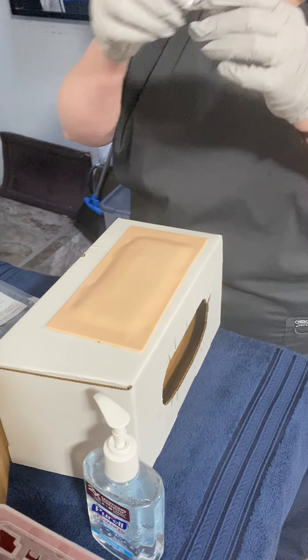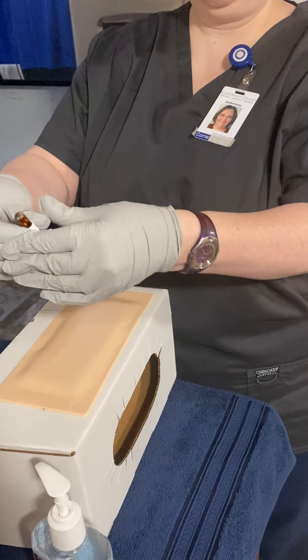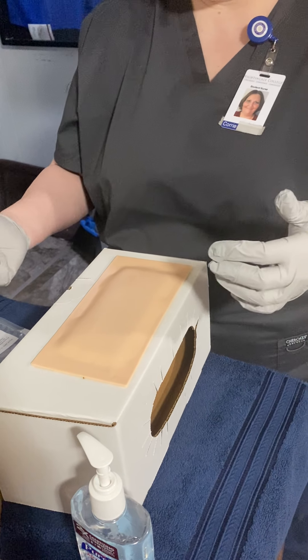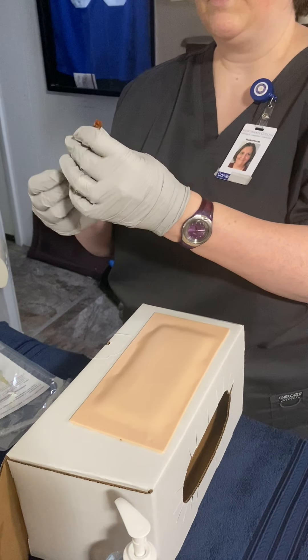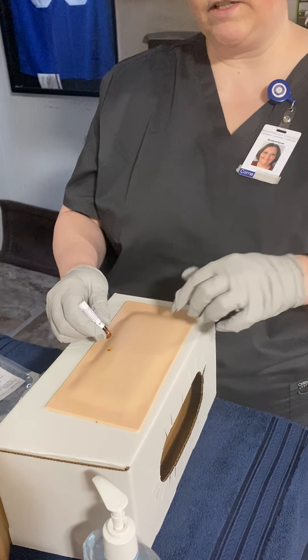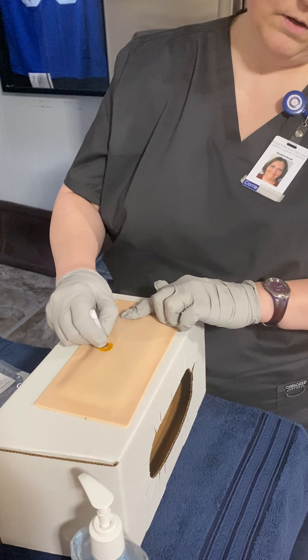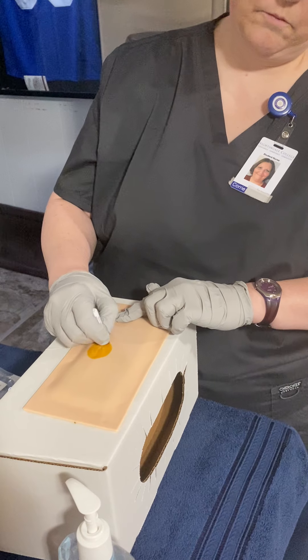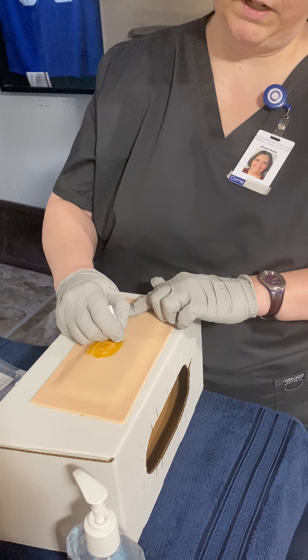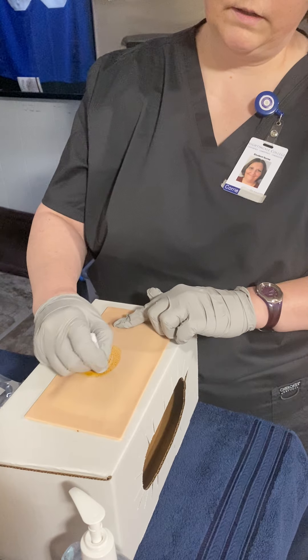I'm going to get my iodine out. With the iodine, I'm going to go in circles starting at my insertion point where I find the IV is the best, and I'm going to go outwards from there for 30 seconds. This just cleans the area — it gets all of the bacteria and any dirt or anything like that that would be on the area where the IV is going to go. All right, so we're going to let that dry.